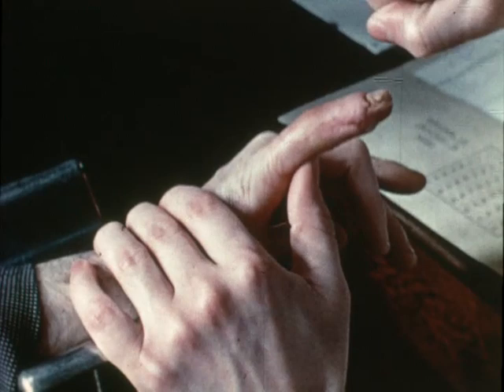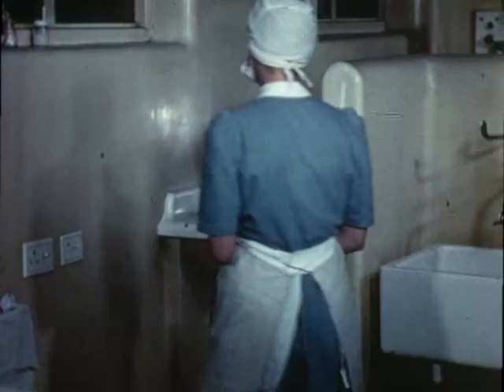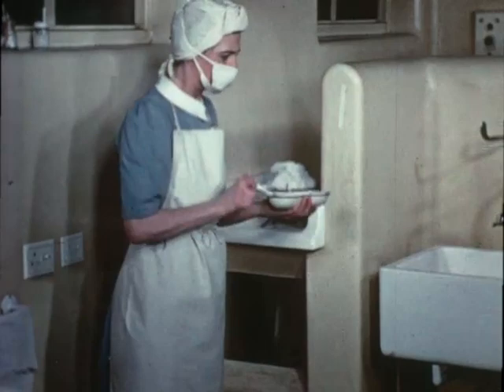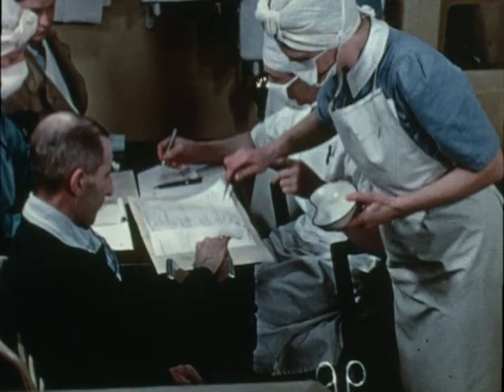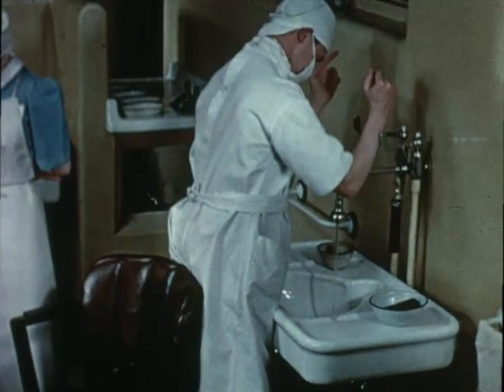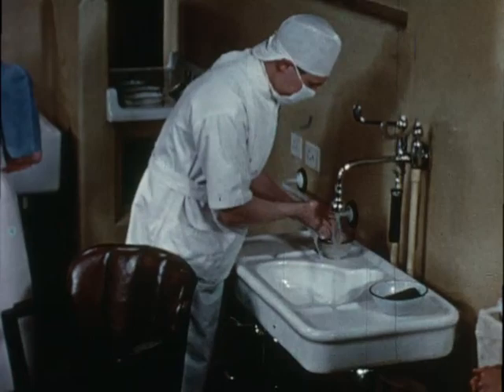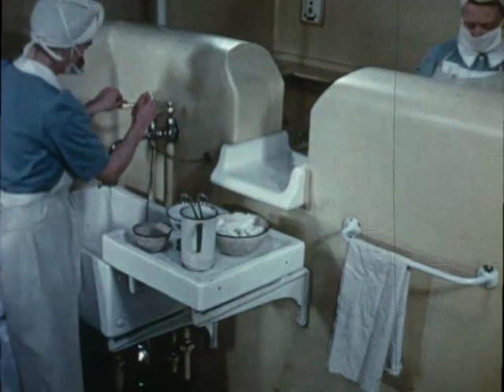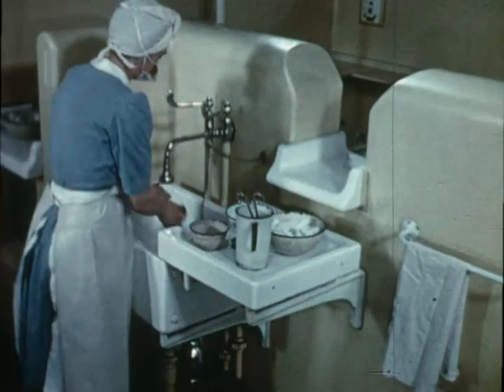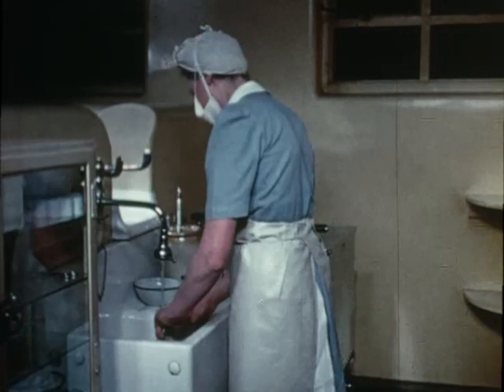In this case the doctor has to touch the patient's hand to make an adequate inspection of the wound. Even if he touches the skin some distance from the wound he must afterwards wash his hands. The nurse is collecting the materials for a temporary wound cover from the sterile stock, and while she applies this to the wound the doctor finishes dictating progress notes to the secretary, taking care not to touch anything with his left hand until he has washed. The server cleans the instruments at the sink below the hatch, puts them in the steriliser and then washes her hands. In this way she maintains a flow of clean instruments for the dresser.